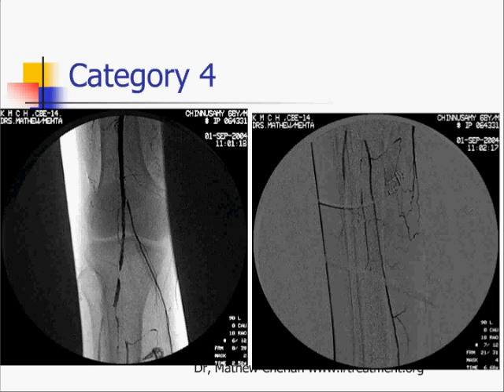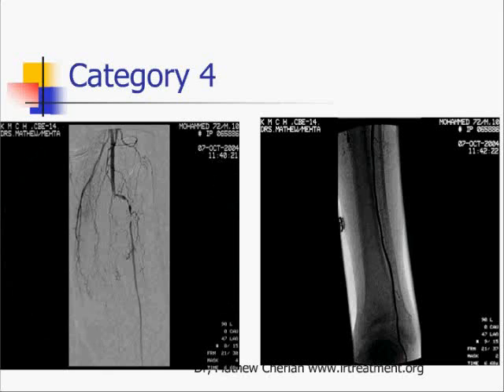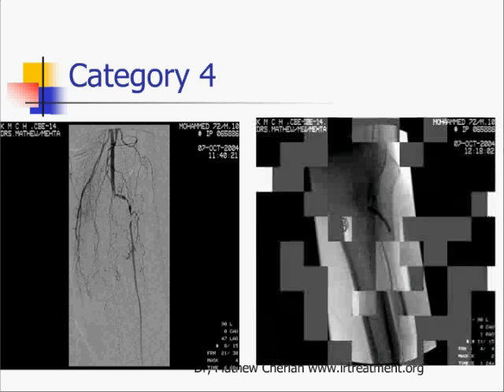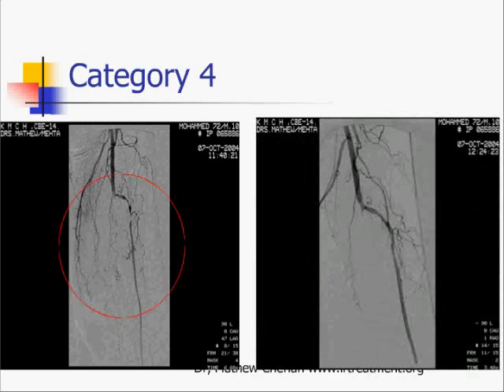Here is a patient with a category 4 lesion. You can see multiple stenoses in the popliteal artery with extensive disease of the tibial vessels, and this is the end result after angioplasty. You can see another category 4 lesion — single vessel run-off with extensive stenosis of the anterior tibial — and this is the balloon and the end result after angioplasty.